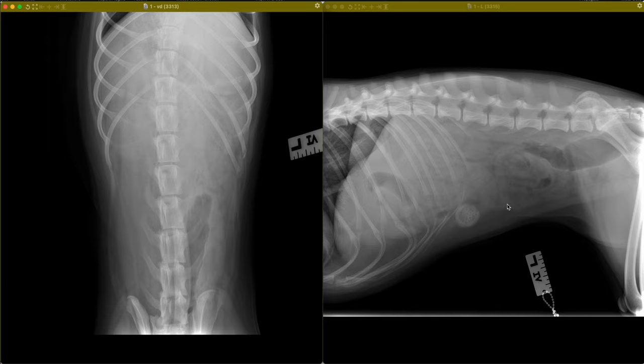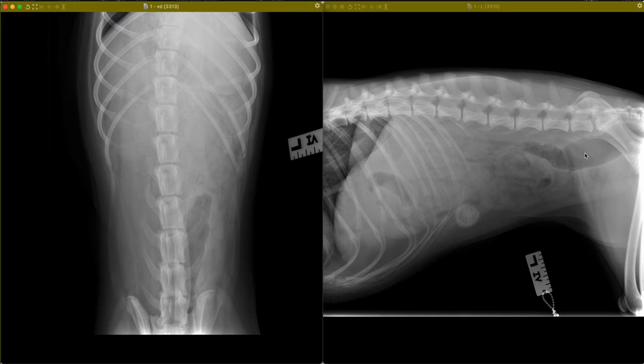The remaining small intestine is relatively narrow in diameter, so it's pretty empty and either contains a small volume of gas or is more uniformly soft tissue opaque, which could be empty and flat or contain a small volume of fluid. The descending colon and rectum contain predominantly gas. The two populations of small intestinal morphology would be consistent with intraluminal foreign material with secondary mechanical obstruction.